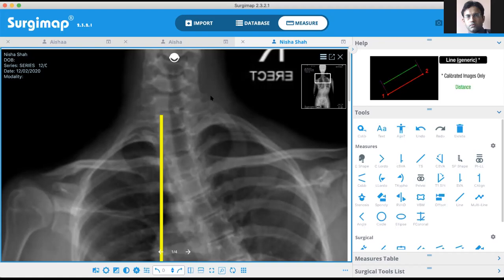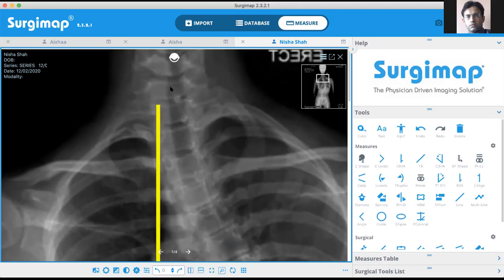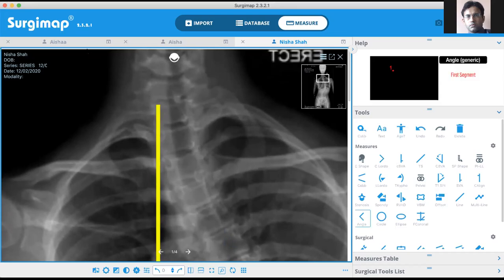So what we finally thought is that we can just enlarge it and try to guess where the central point of the body is, and I think we can pretty much guess it will be starting from here. So again, for this we'll have to take the angle. This time we can just go to the upper edge of the vertebra, the upper edge of the X-ray line. Again, you see how the line is turning pink, so that is horizontal, and I leave it over here. And then I come to the C7 center point, and from here I'll draw a line.